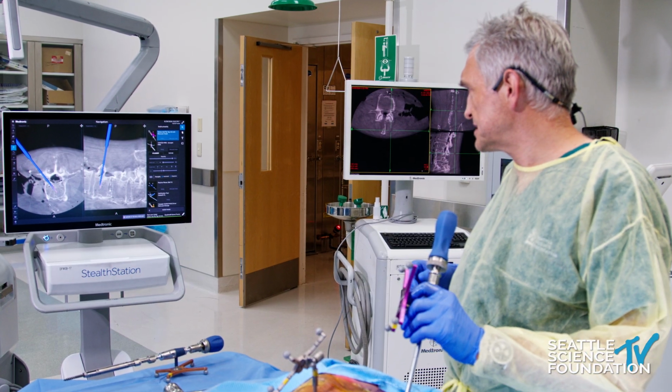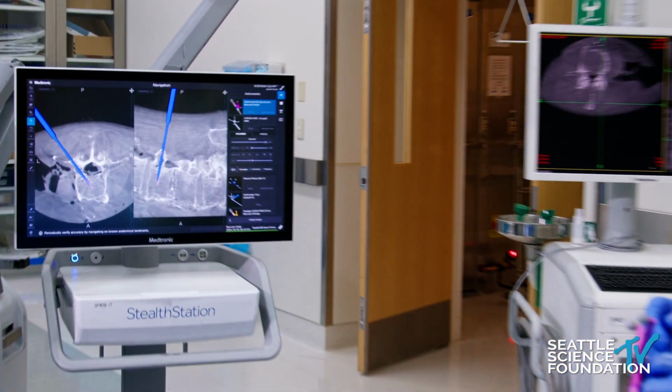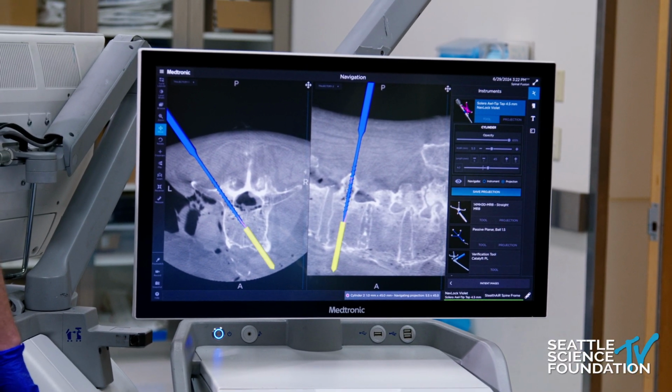So now at this point, I would ask them to put the trajectory, or we can use the same trajectory, I guess. Hey, Roger, at this point, do you ever get an AP X-ray to check your accuracy at the beginning, or do you normally don't do that?